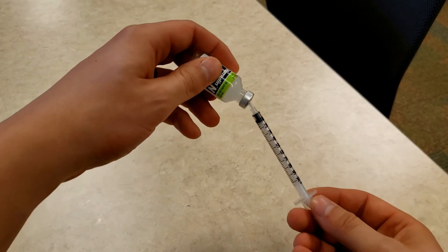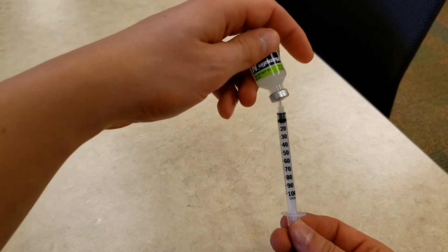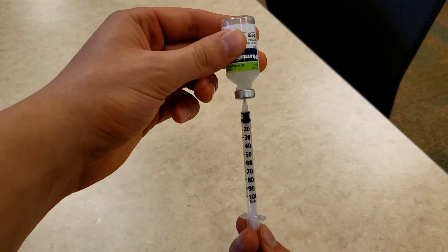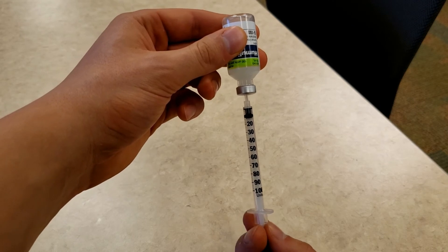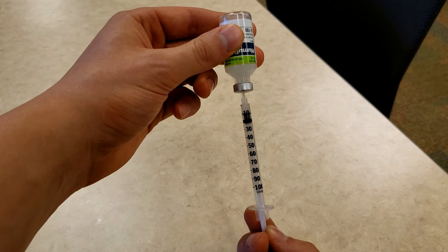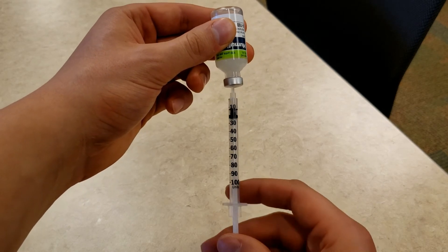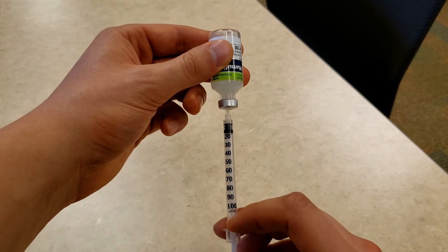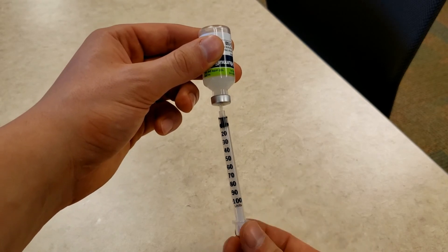Using two hands, turn the insulin bottle and the syringe upside down, making sure that the syringe is still in the bottle. Pull the plunger down slightly and draw some insulin into the syringe. Then push the plunger and the insulin back into the bottle to remove any air bubbles.